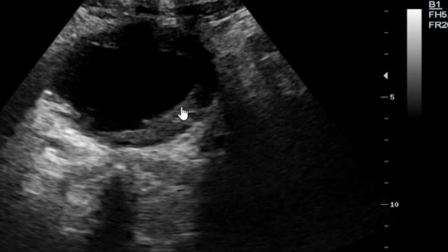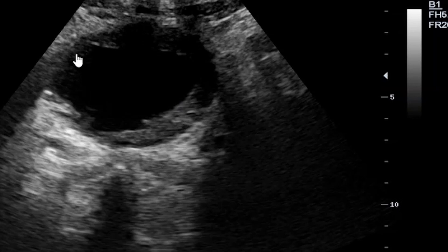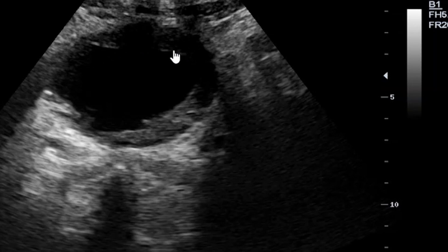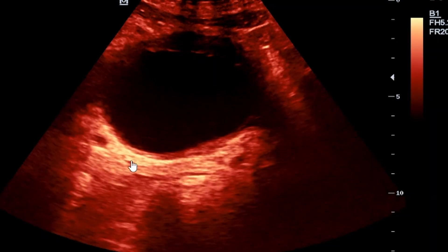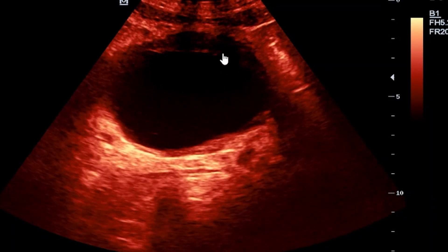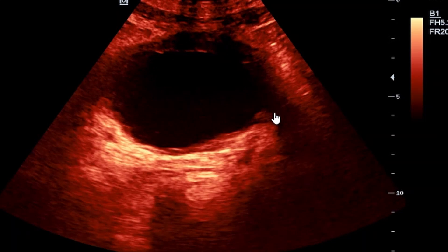It is very pertinent that when doing an ultrasound scan, you check and measure the thickness of the walls of the urinary bladder. At the same time, you have to check the urine for any anechoic nature, particles, stones, or sludge that you can appreciate on the scan. On this tint map image you can also appreciate the thickening of the urinary bladder walls, which is in keeping with cystitis.